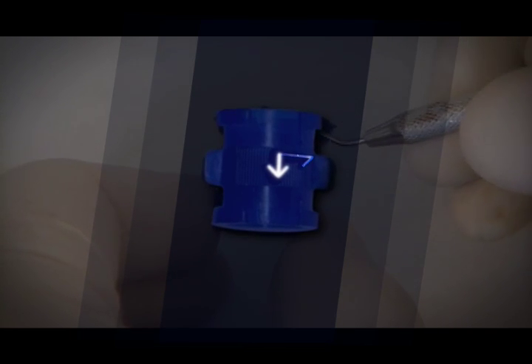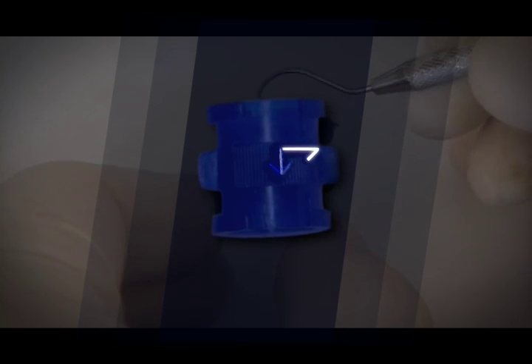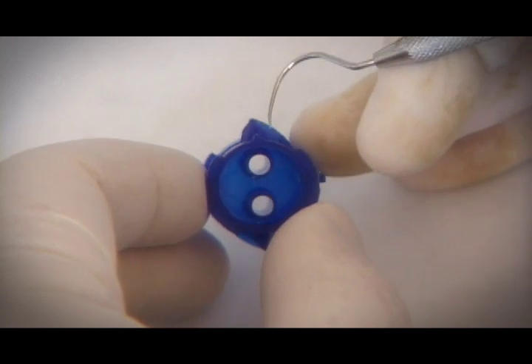There are two arrows: one pointing down into your recipient, and another triangular point on the opposite side of the coupler that goes into the donor. Another arrow points in the direction to turn the coupler to lock the cartridges together. The arrow pointing down points to a triangular tip that lines up the tubes that connect the cartridges.